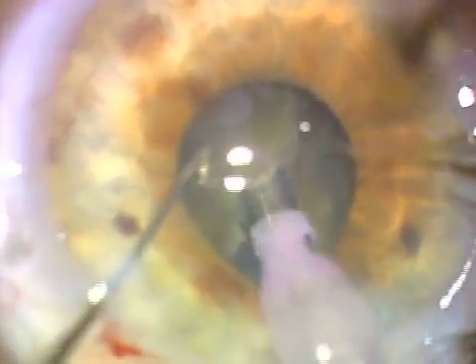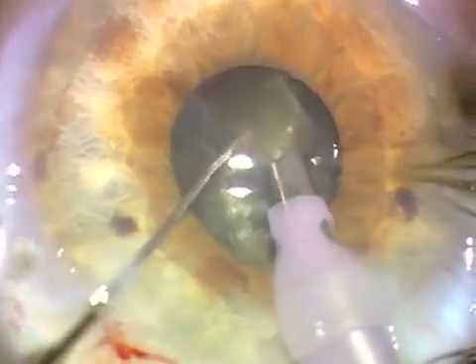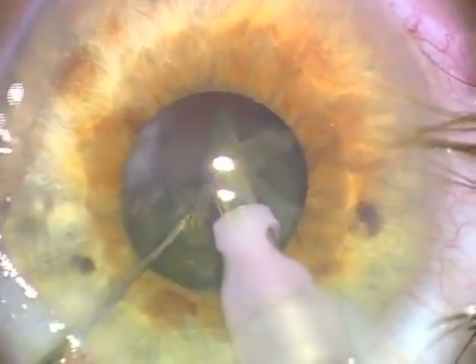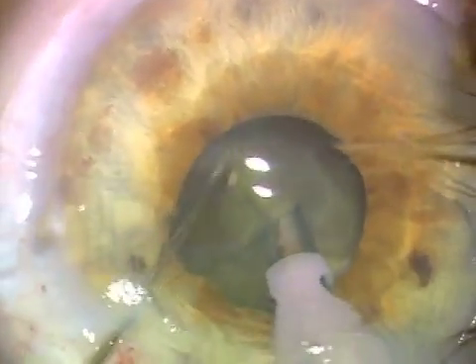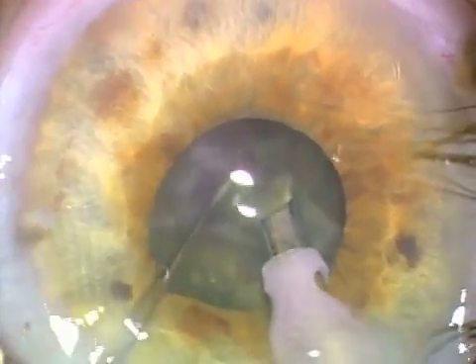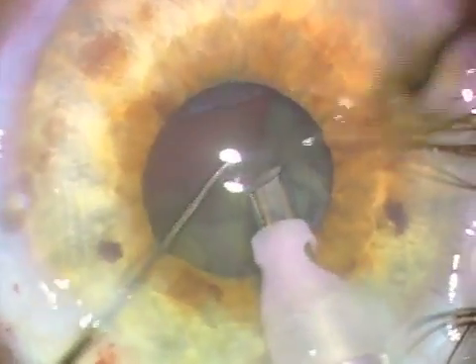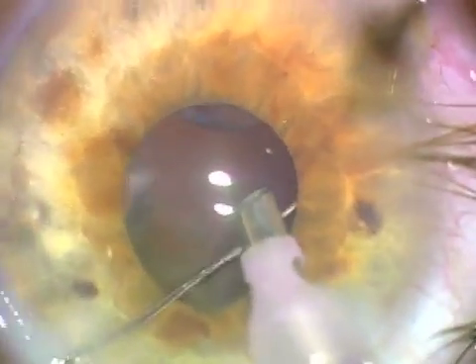I do use dispersive viscoelastic, and if I use Viscoat I like to use the soft shell technique with DuoVisc as described by Steve Arshinoff. The soft shell technique maintains better visualization because the viscoelastic pushed up against the cornea is just a shell there that has a smooth interface with the aqueous and is less likely to trap lens particles and distort the view.